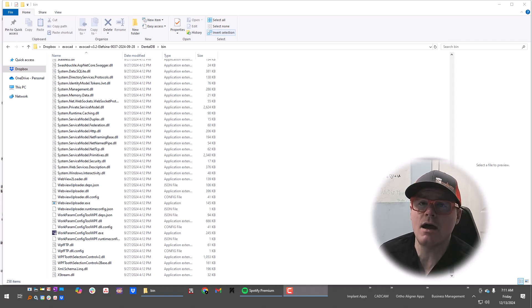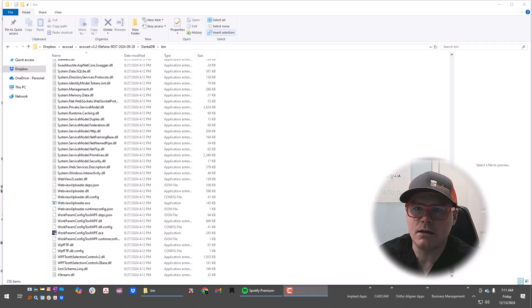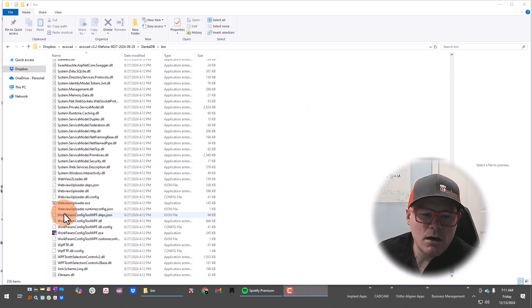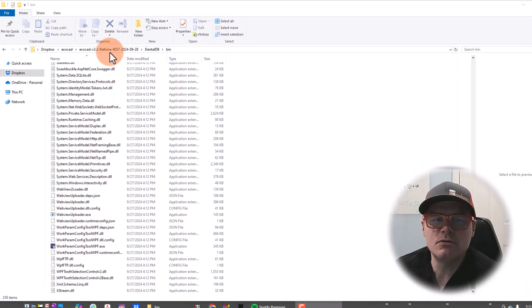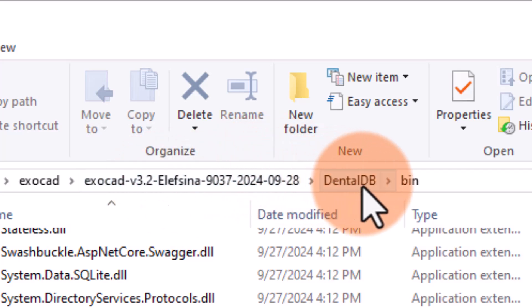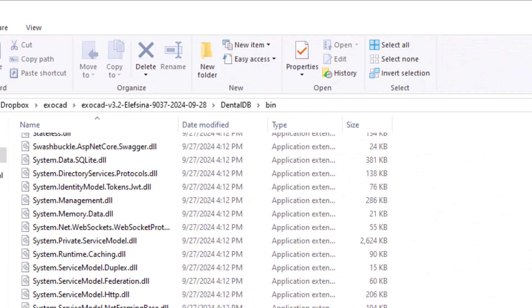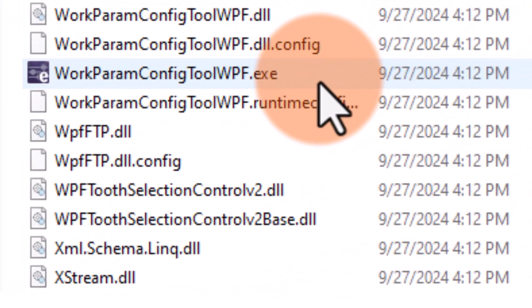When we use the AI crown workflow, we really don't have to put in any additional settings whatsoever — it's just click and let ExoCad do everything as we tell it to. The way that we find the work parameters configuration tool is to go into your ExoCad folder. It is in the dental DB folder, slash bin, and the name of the file is work param config tool WPF.exe.